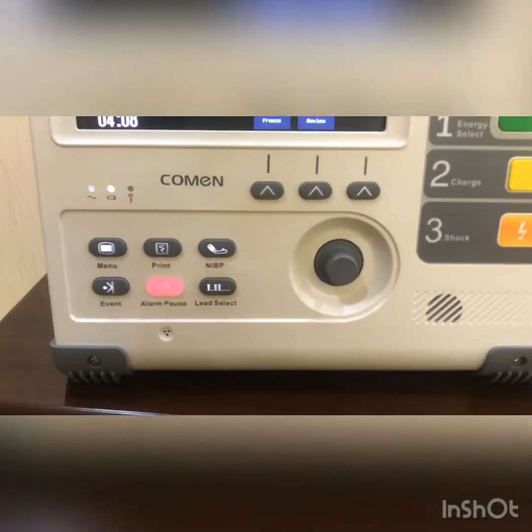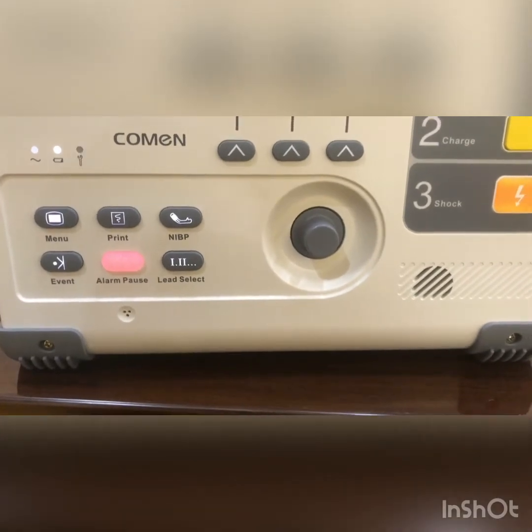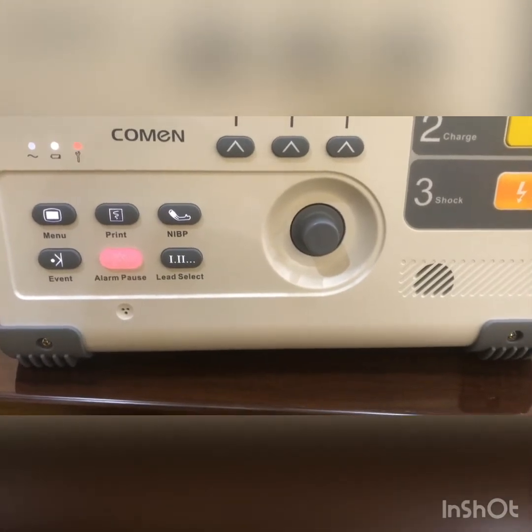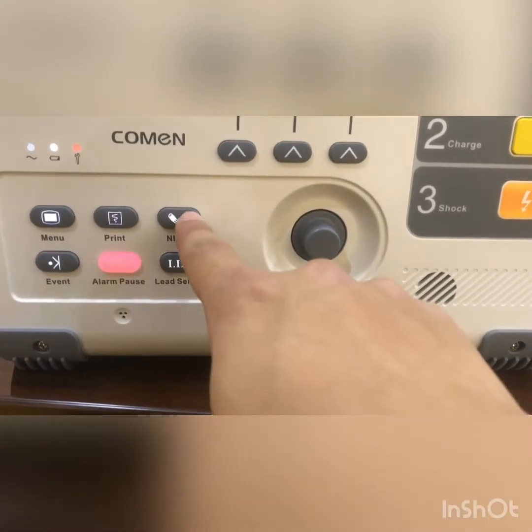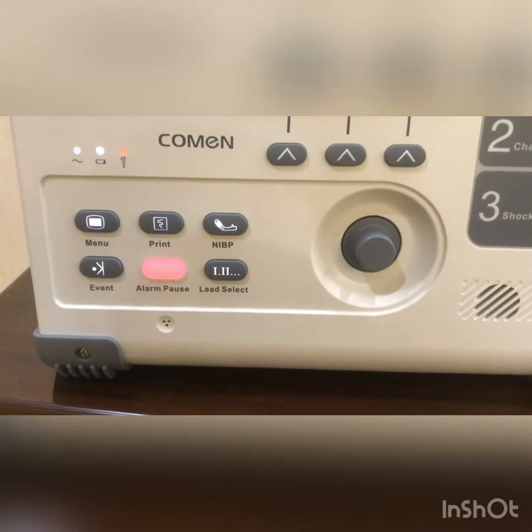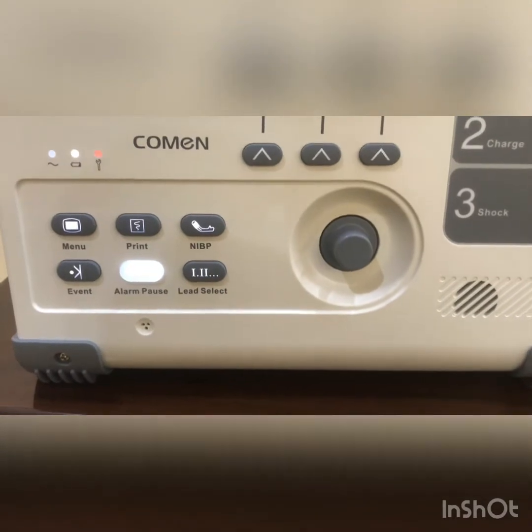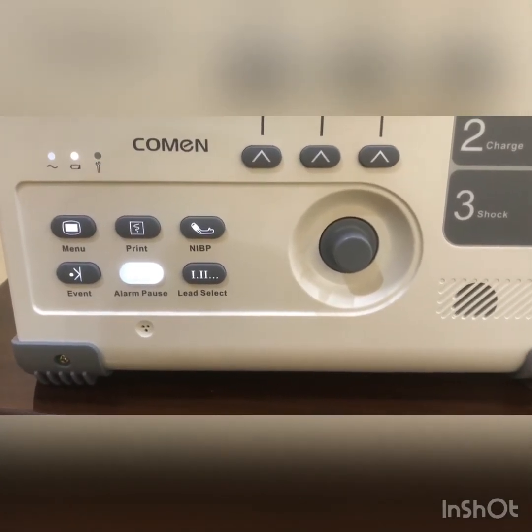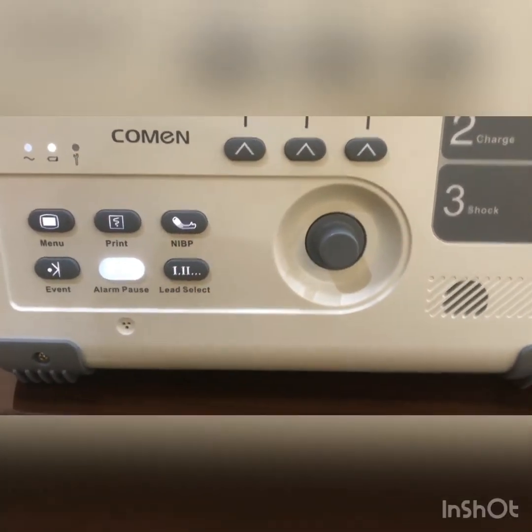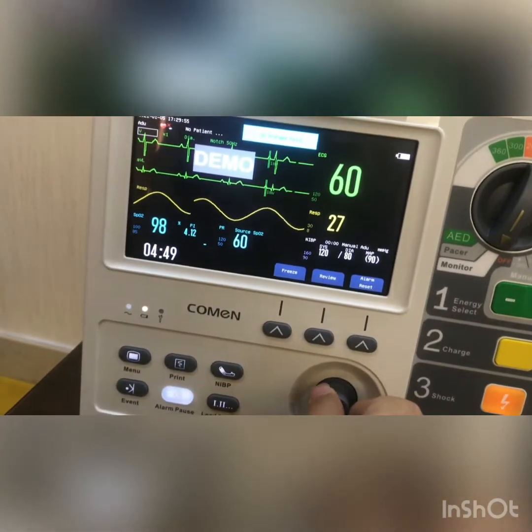Okay, let's take a look at here. We got the menu button, print button. You can print the trend or waveform from this button. You can use our built-in thermal printer. And if you want a faster NIBP measurement, just press this button. And we got the event marker here. And you can pause the alarm by pressing this button. And you can set up the lead selection by pressing this button. And you can use the rotary knob to select whatever you want.